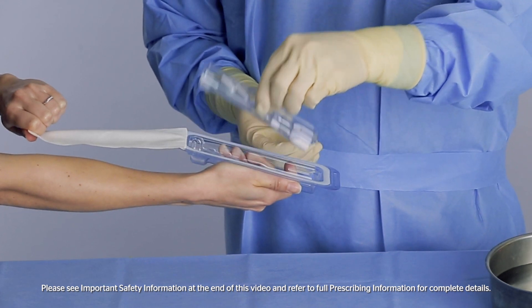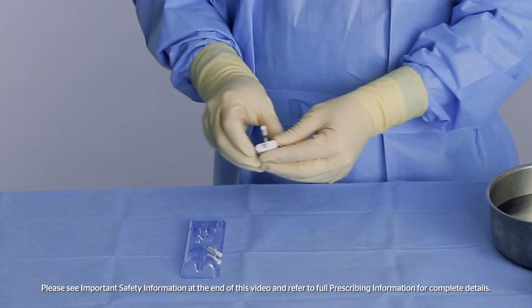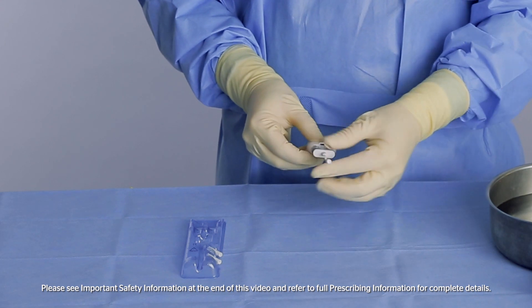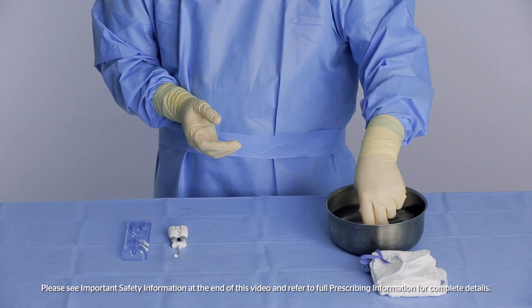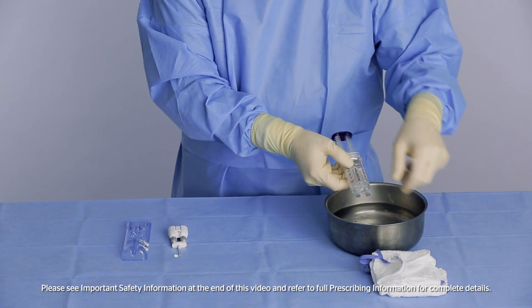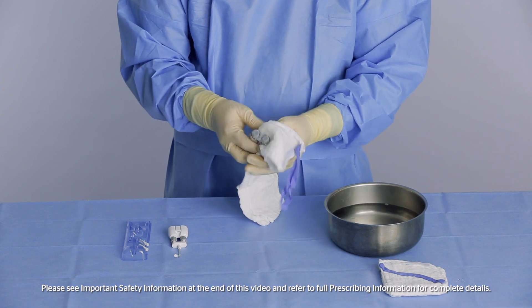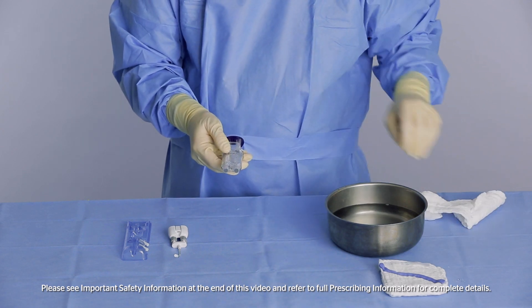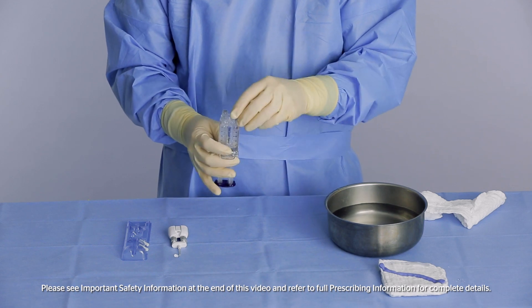Open the blister pack containing the airless spray accessory. The malleable dual-lumen tip can be bent into the desired position and will retain its shape. Unscrew and discard the luer caps, making sure to keep the syringe holder upright.